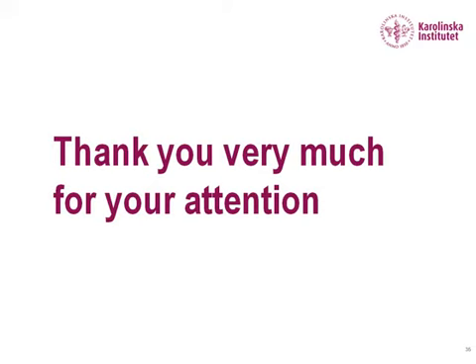Thank you. I have one comment to make. A flow of 10 liters per minute with CO2 will lead to a dramatic increase in pCO2 measured in the blood. So the gas flow in your oxygenator needs to be turned up in order to eliminate the CO2. So there can be a problem with borderline size of an oxygenator in pediatric, for example. If you have a certain flow range and you have an oxygenator that has a limited capacity and you increase CO2 flow, you may not be able to eliminate it. So that's something to think ahead of if you're using this technique.